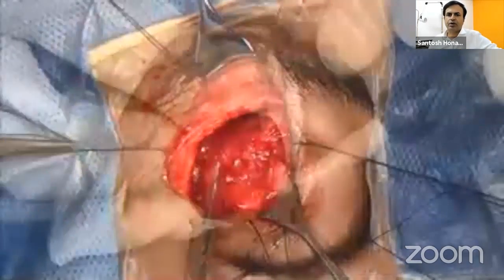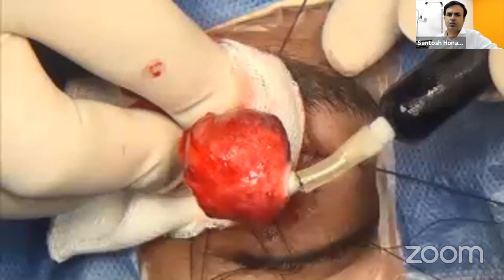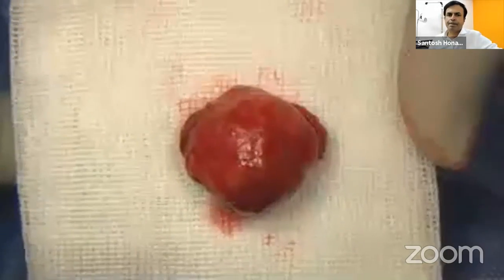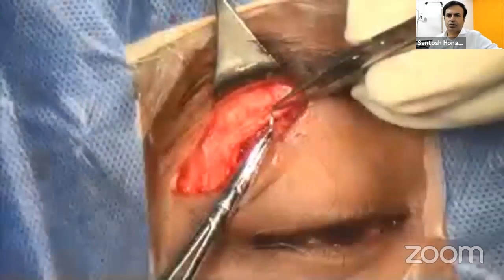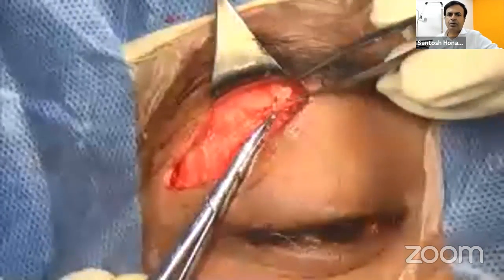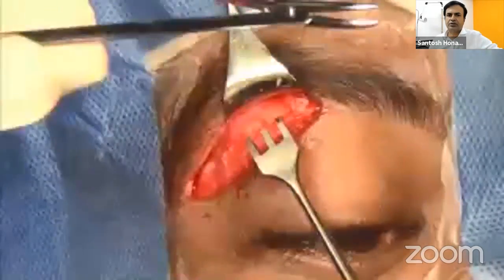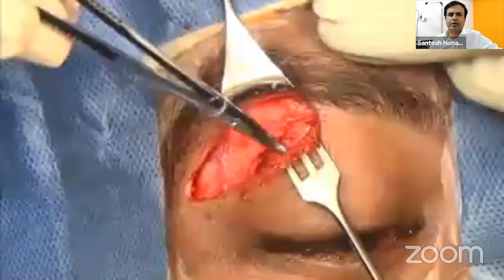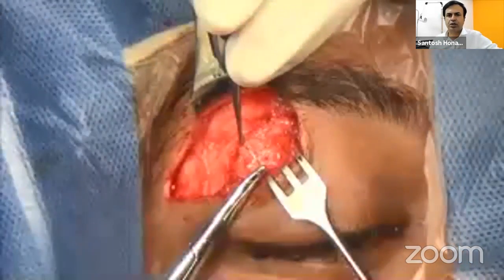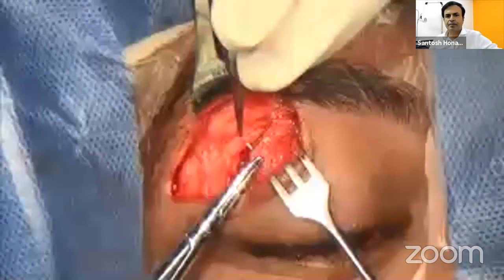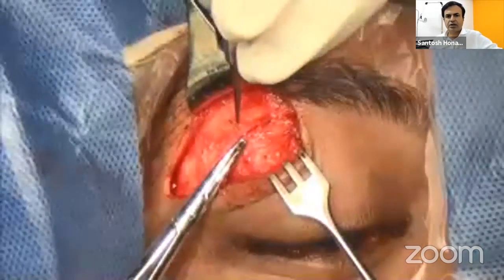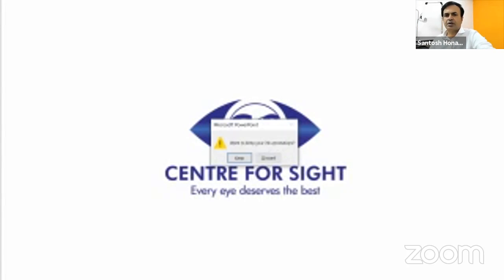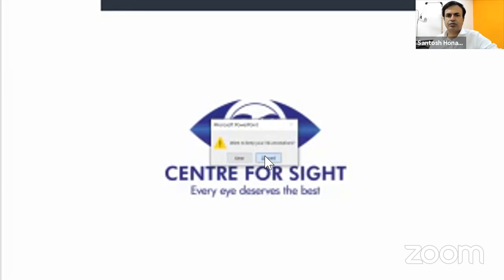After the tumor is removed, wait four to five minutes for hemostasis under external pressure. Ensure the patient's systolic pressure is at least 100 mmHg before starting suturing — reversing the hypotensive anesthesia effect. Then suture the periosteum, orbicularis, and skin. That concludes this portion; the rest can be covered next time.